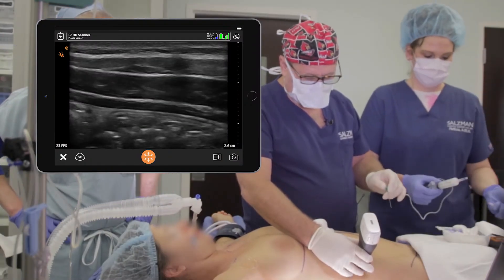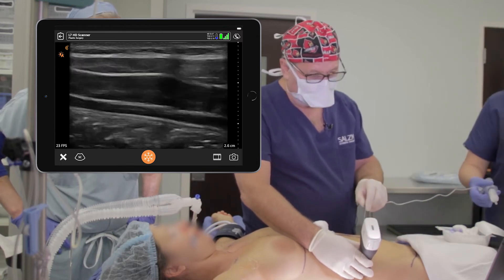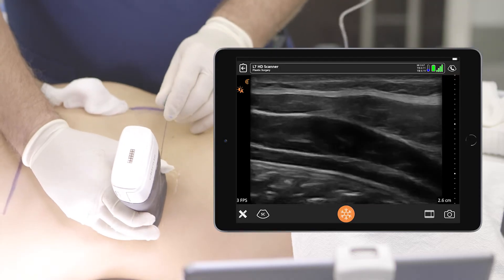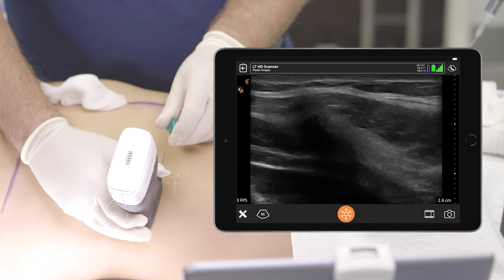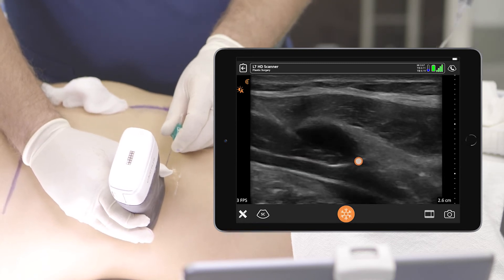I'm starting between the costal margin and the anterior superior iliac spine, almost at the axillary line. The further out I go, really the better the block is going to be. I'm putting this through the skin and following the needle down — I can feel it go through the external abdominal oblique and I'm right on the internal. I just felt it pop through the internal.